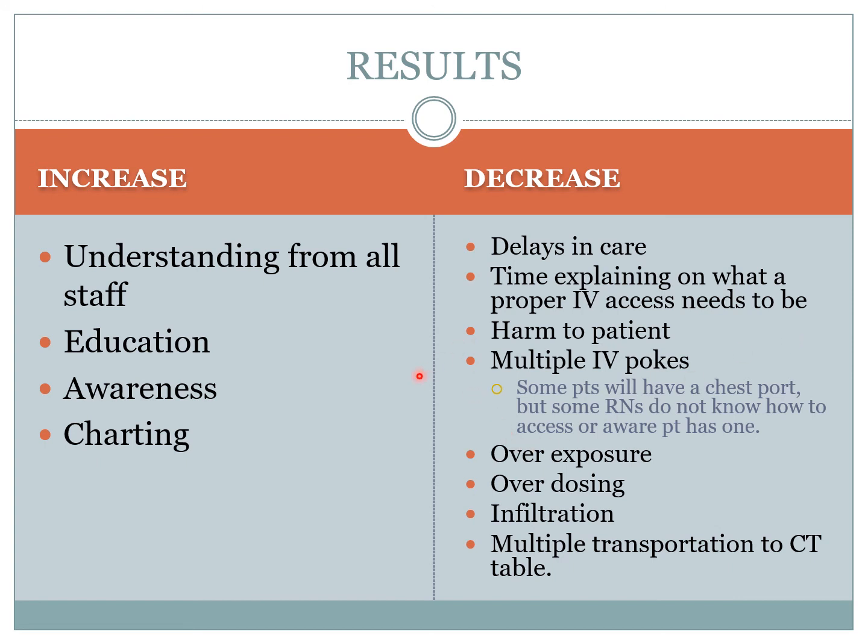And as I mentioned earlier, this will decrease harm to the patient, harm to ourselves, harm to everyone working on there. Less pokes to the patient, less radiation exposure, and we don't want any infiltration because that's no fun. That could be really bad for someone, especially if they're an older patient and their skin's very fragile and there's infiltration, then it's so much more painful for them.